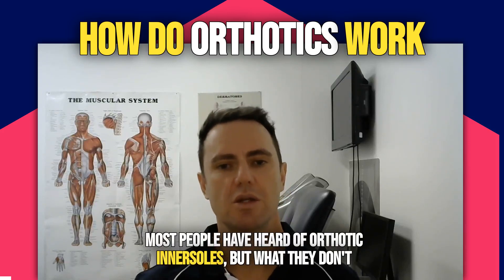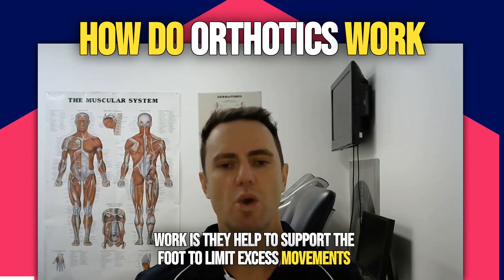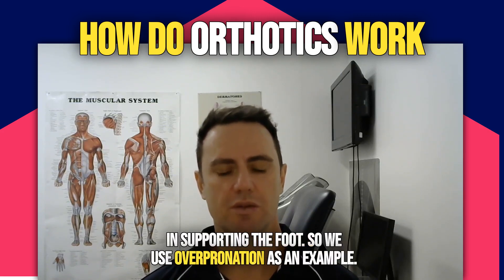Most people have heard of orthotic inner soles, but what they don't understand is how they work. Orthotic inner soles work by helping to support the foot to limit excess movements, so that the active components of the foot don't need to do this work in supporting the foot.